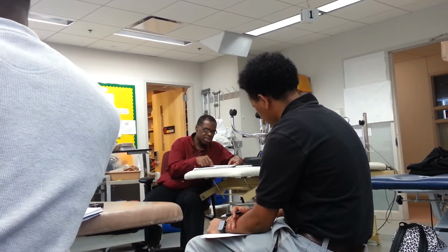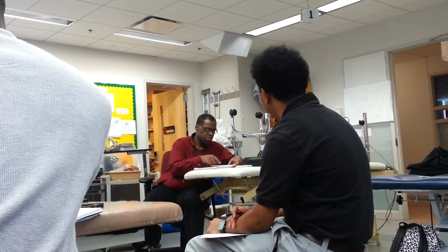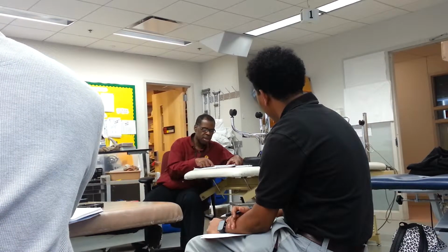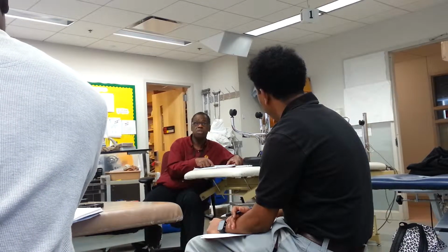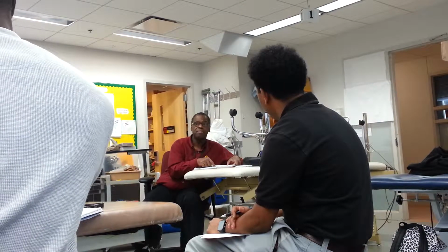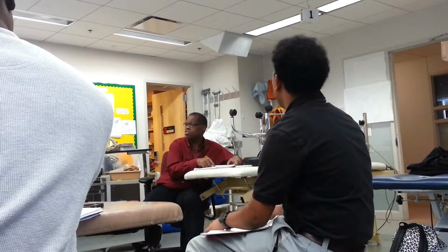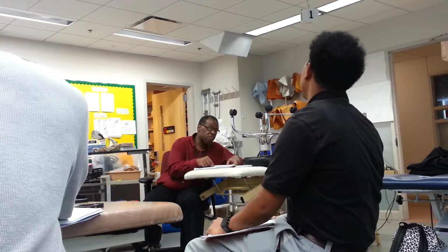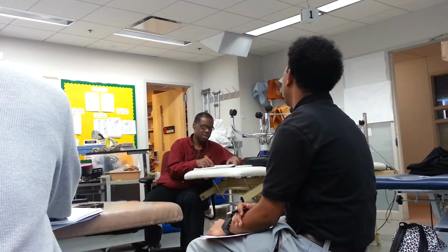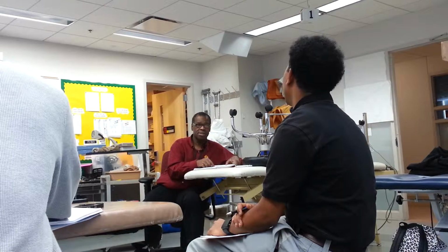What will be the intensity for muscle spasm and muscle weakness? Motor. What would be the pulse width for muscle spasm and muscle weakness? 200 for both. What will be the pulse rate for muscle spasm? 100. What would be the pulse rate for weakness? 50. I don't want to fatigue it. What will be the mode for weakness?